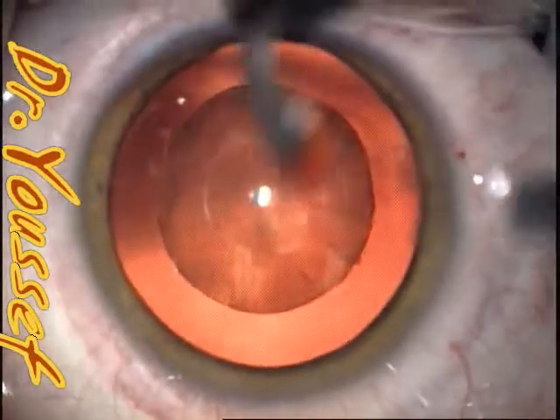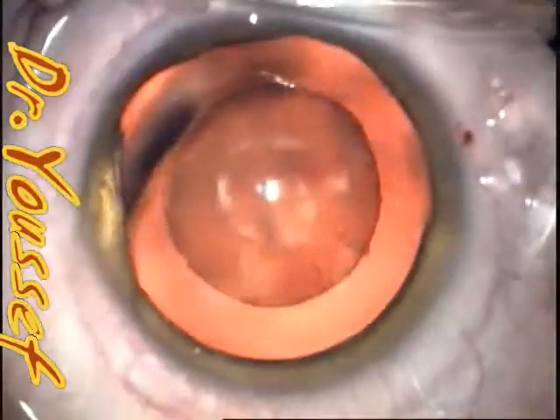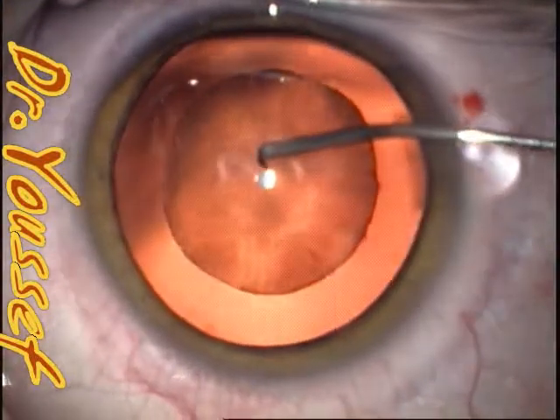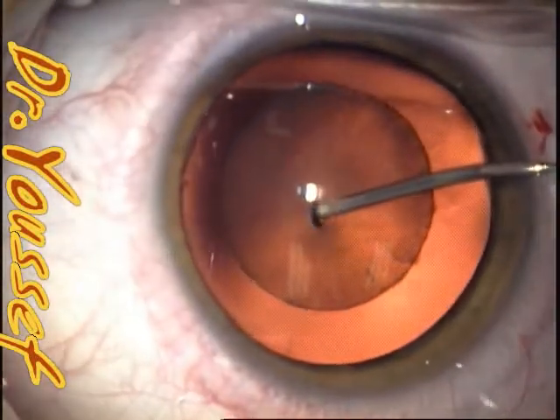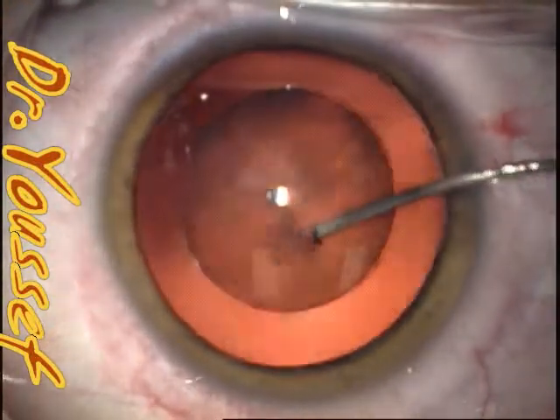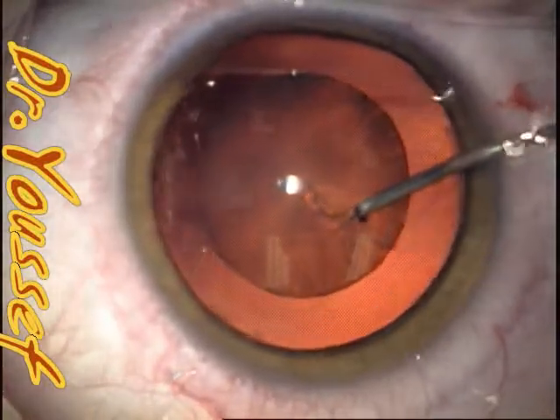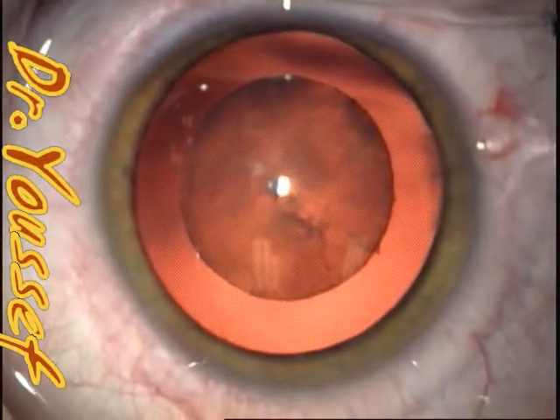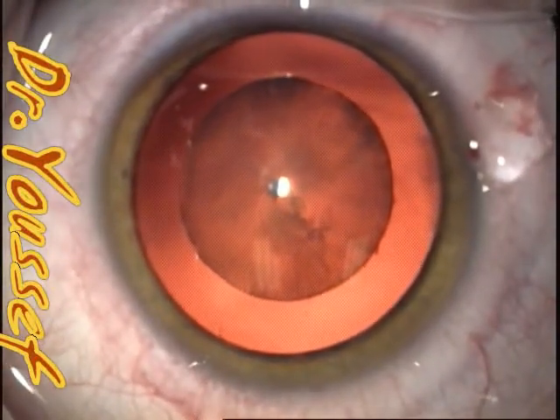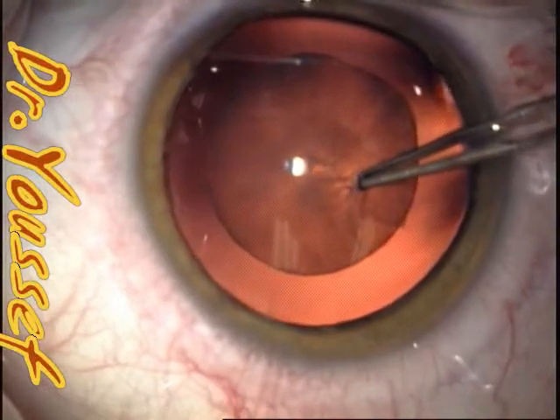It's very tricky to do the capsulorhexis. I usually use the cystitome to open the capsule, but here it's very elastic, so you have to use something sharp. I'll use the cystitome first and then capsulorhexis. Because the capsule is very elastic, you have to be careful with the direction of pulling. Normally we pull toward the direction we want the capsule axis to run.